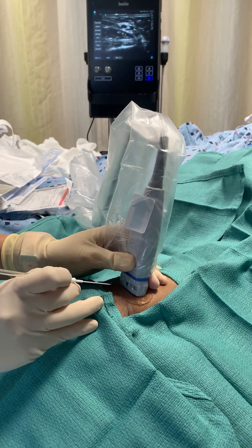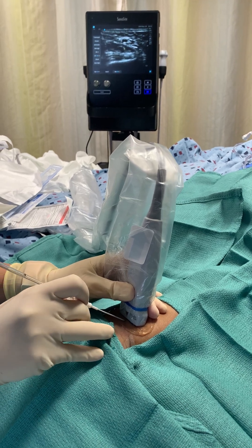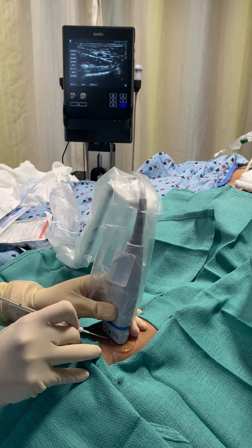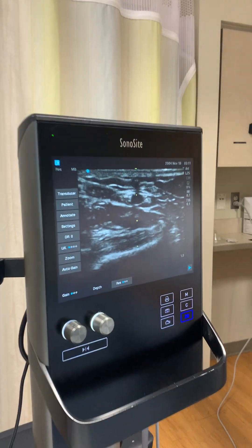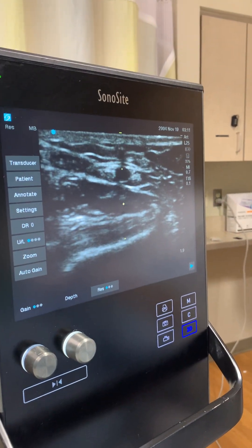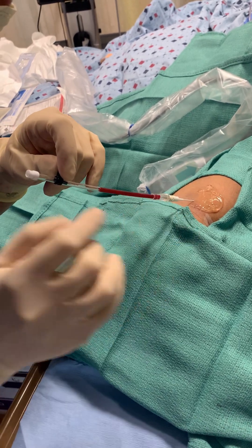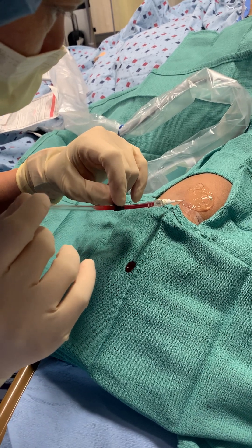We tend to put the needle on the middle. You can see my needle going in. If you come back here, you'll see blood. The artery has positive pressure, so the blood goes up. That's how you would know that you are inside the vessel.